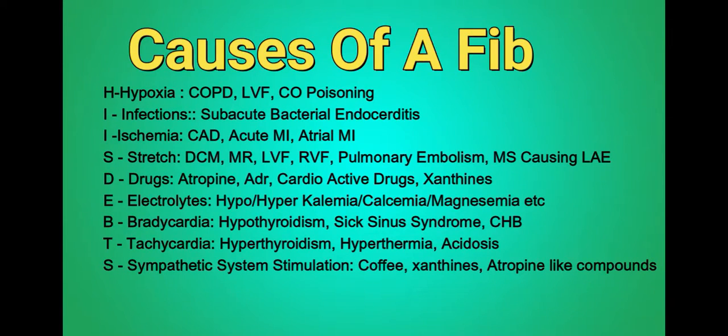And sometimes the patient will come to you with chest pain and you do the TROP-T, it is positive, and you look at the ECG, it is normal looking. In that case, you should look at the ECG again, look at the P waves, look at any elevation of the distal descending limb of the P wave in certain leads, and which might signify atrial MI.